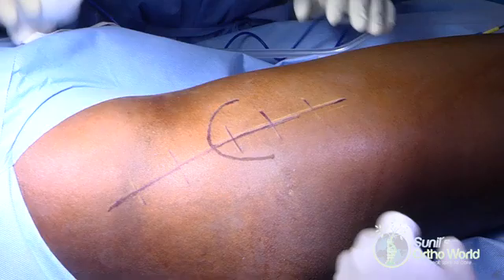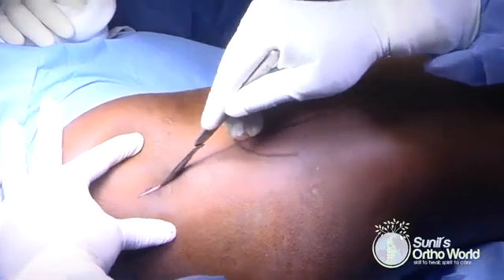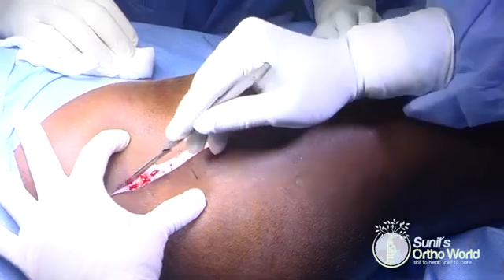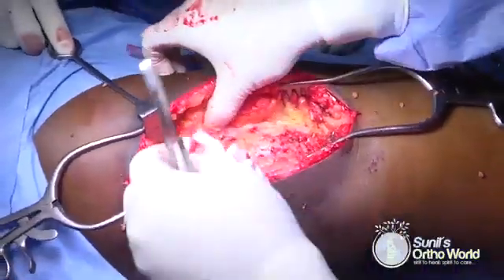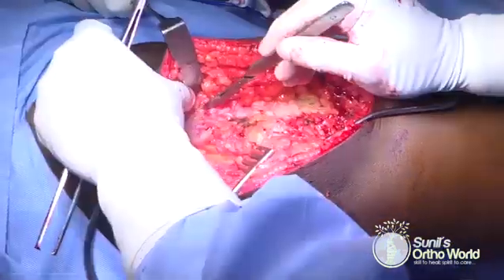The landmarks for surgical incision include the long axis of the femoral shaft and the greater trochanter. A 20 cm straight incision is made centered over the greater trochanter in line with the axis of the femoral shaft. The incision is taken down to the subcutaneous tissues and the fascia over the gluteus maximus muscle and the tensor fascia lata are exposed.